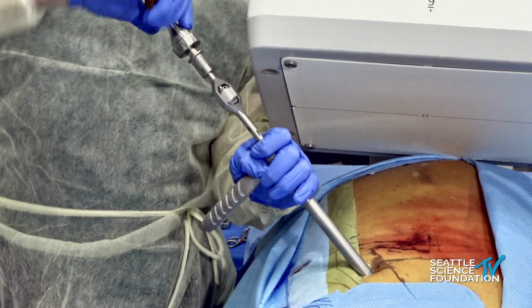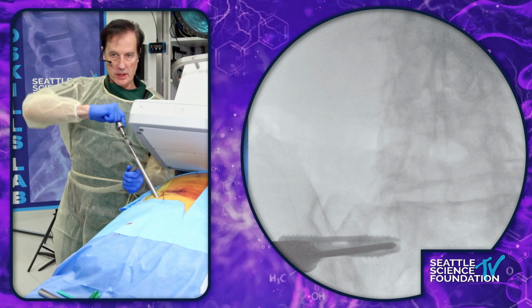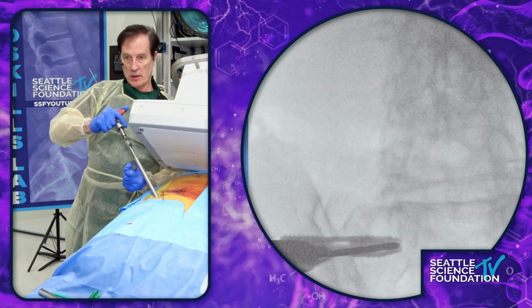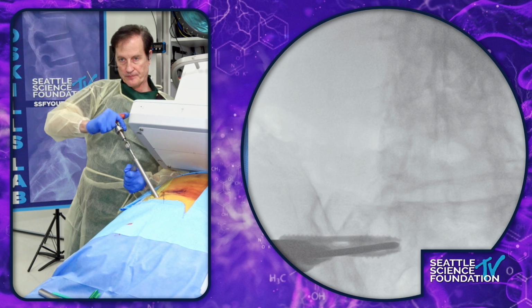That's a very nice addition. So, picture. All right, so you can see this getting right across the SI joint. And again, we'll try this without. Picture that. Good. Starting to go across the joint, and let's go back to the inlet view, if you can, please.